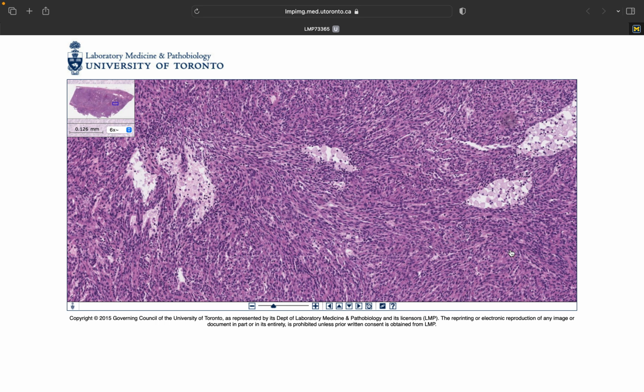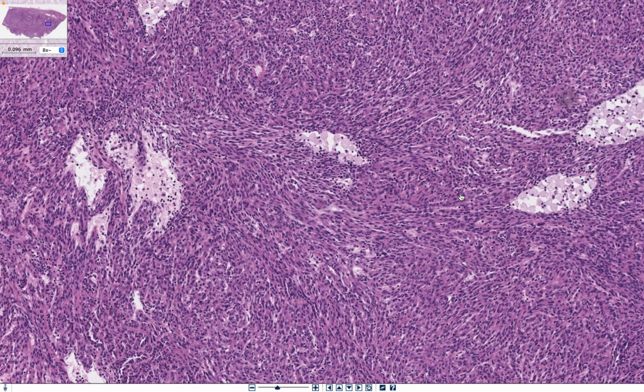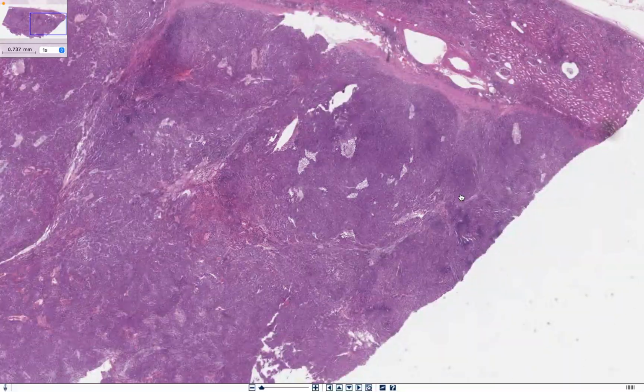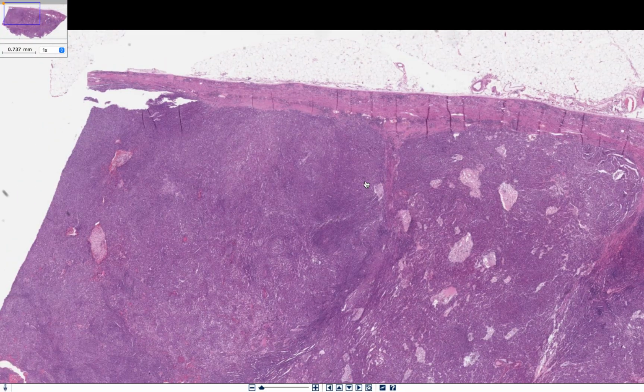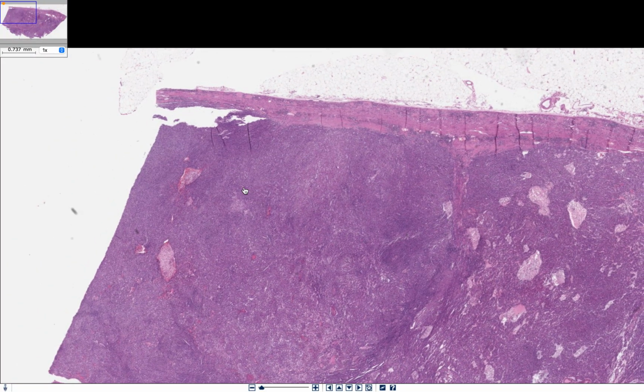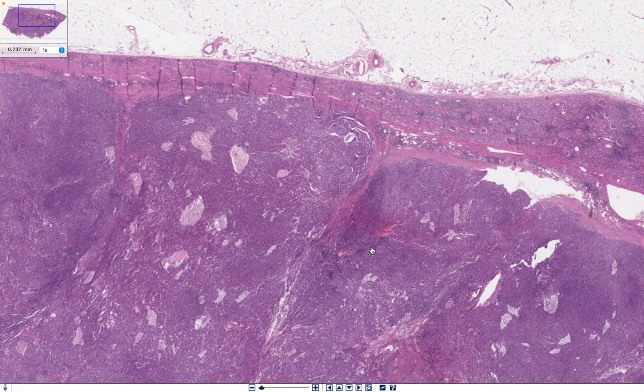Inshallah, I'm going to share with you a nice example of a kidney tumor called mucinous tubular and spindle cell carcinoma of the kidney. Usually it is a low-grade carcinoma. Here we have a representative section from a tumor which is quite circumscribed. Here we can appreciate the normal kidney with inflammation.